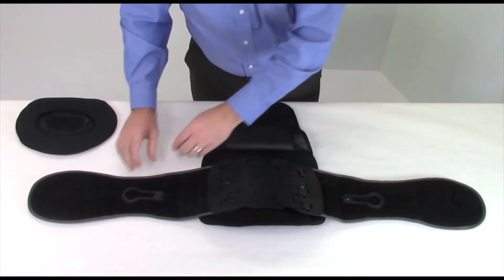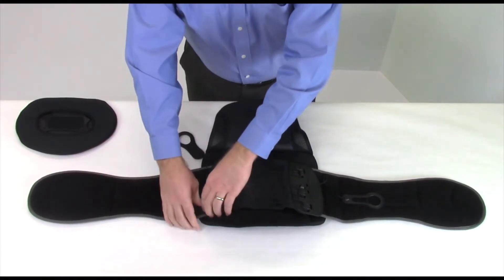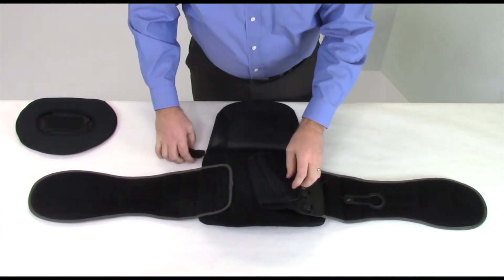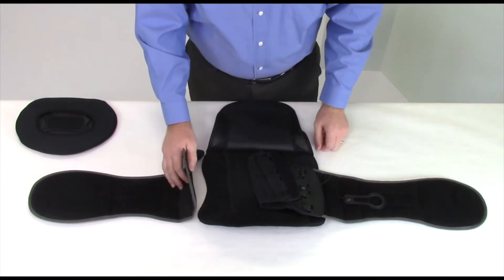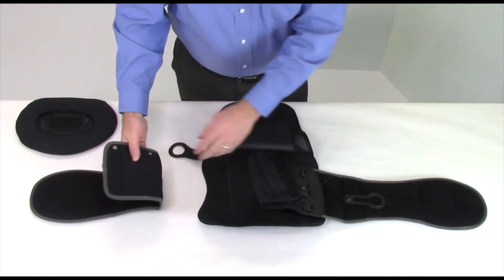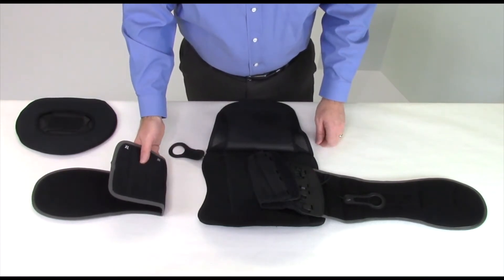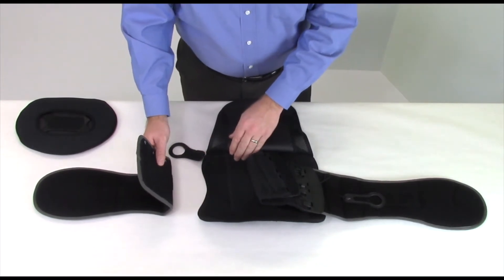Next, detach the left O-ring cinch strap, followed by the left pulley cord frame. Now, adjust the left wrap panel to the desired size by lining up the letter size icon found on the bottom side of the wrap panel with the edge of the back brace frame. A guide for sizing can be found in the directions for use that is enclosed with the device.